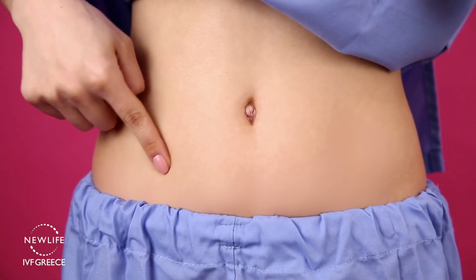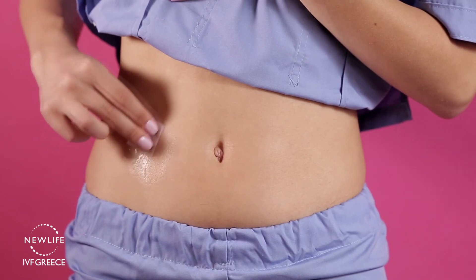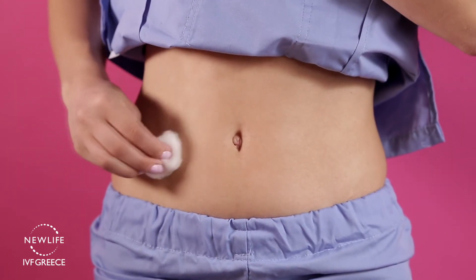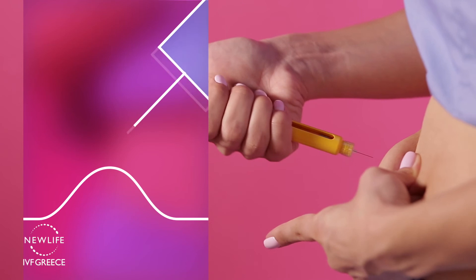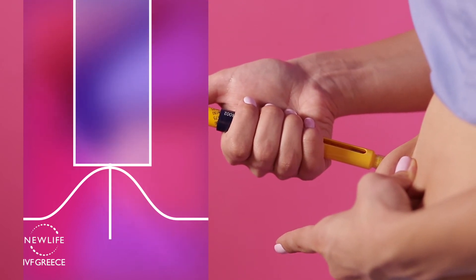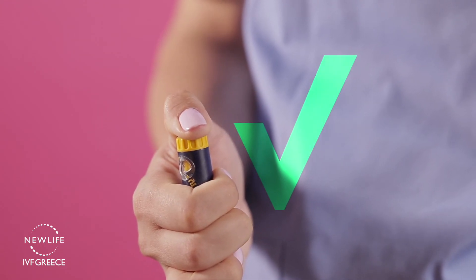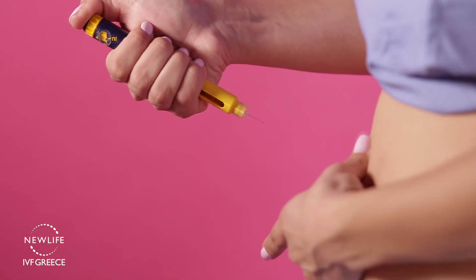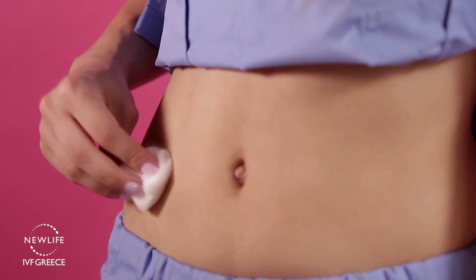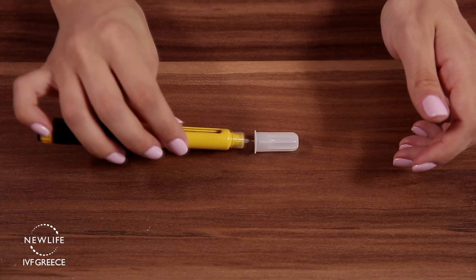After you choose your injection spot, take some gauze soaked in alcohol and thoroughly clean the injection site. With one hand, pinch your folds of skin and insert the needle at a 90 or 45 degree angle. Push the plunger as far as it will go, steadily and without stopping. Take the needle out of the skin and with your cotton pad, massage the area for two seconds to disperse the medication evenly.